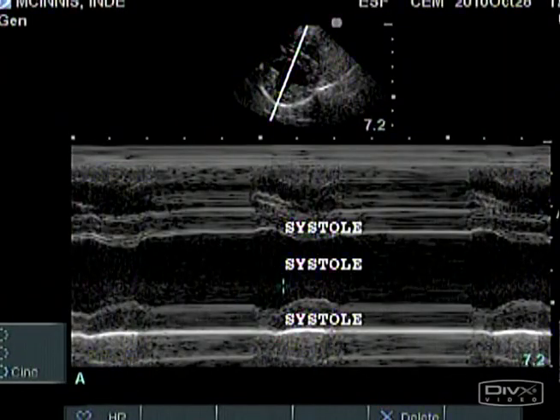Systole is the period of time when the heart muscle is contracting. The heart muscle reaches its thickest appearance and the left ventricular chamber achieves its smallest appearance by pushing the blood volume out through the aorta.